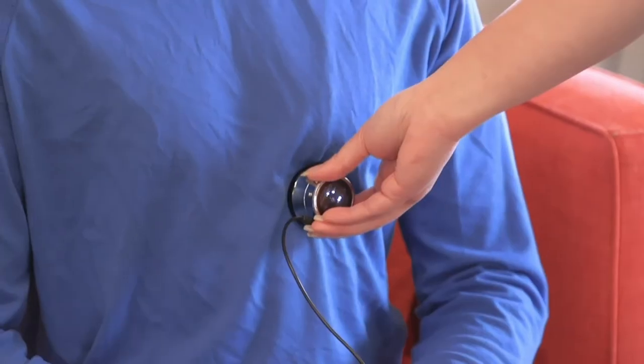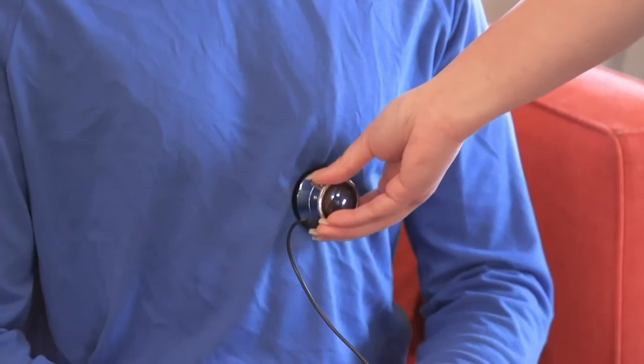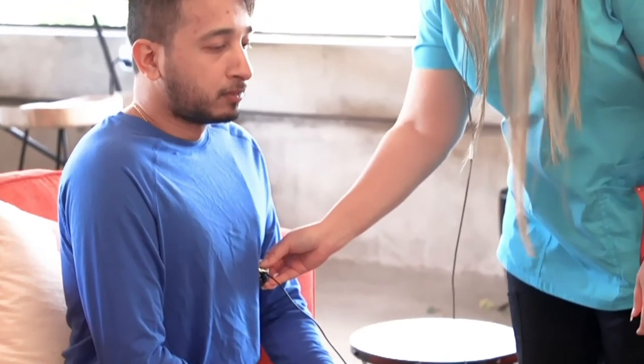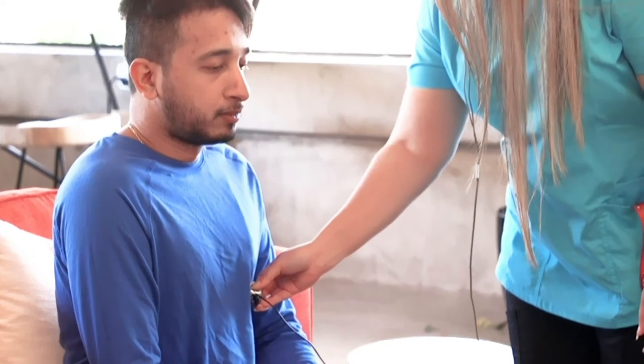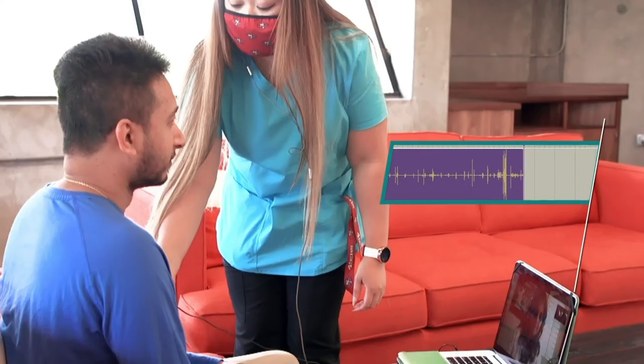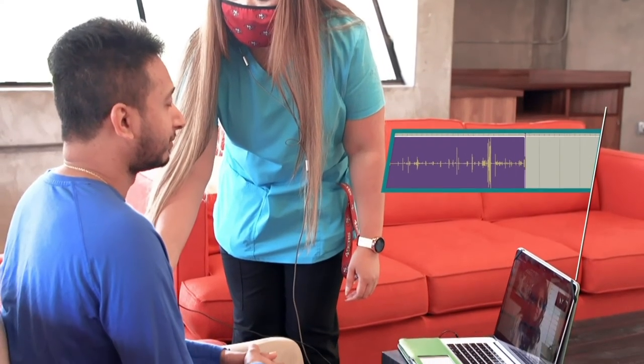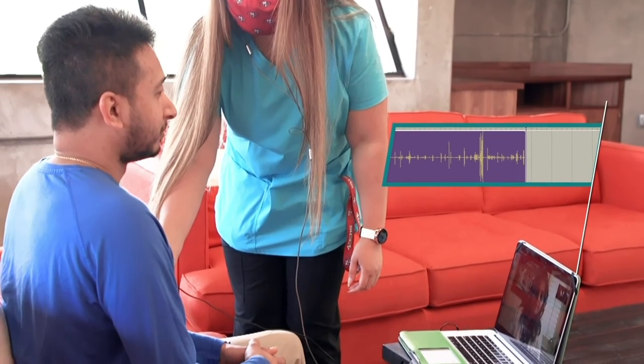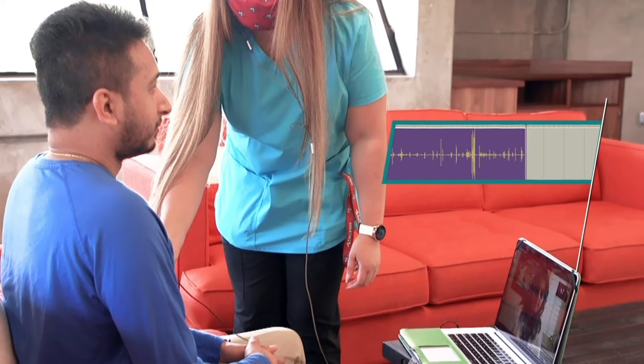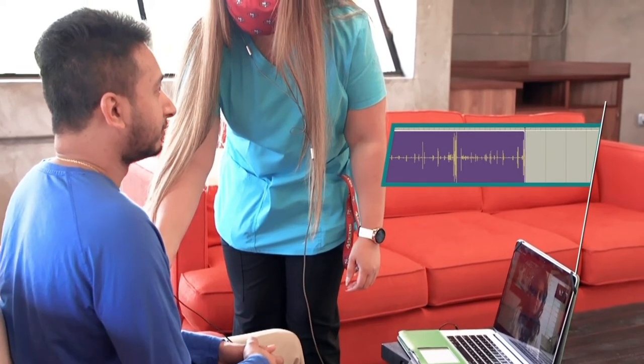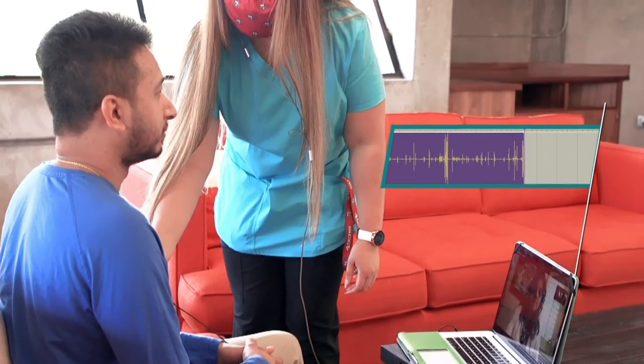The One Stethoscope can be used by nurses or patients at a remote location to enable providers to listen to patients' heart and breath sounds over a video encounter. In order to use it during telehealth visits, nurses or patients need to go through the following steps.